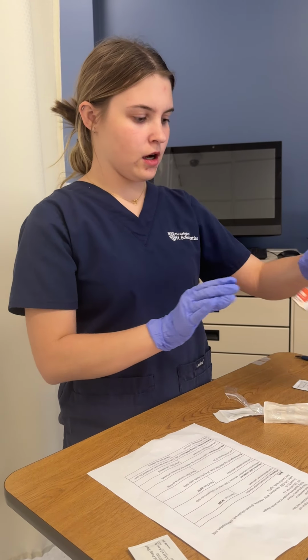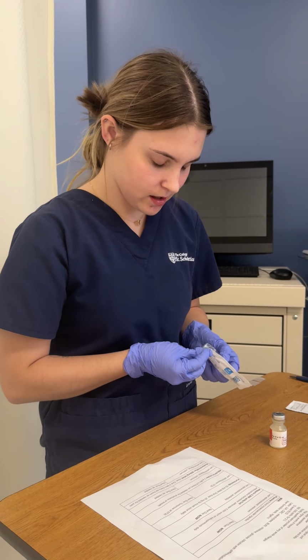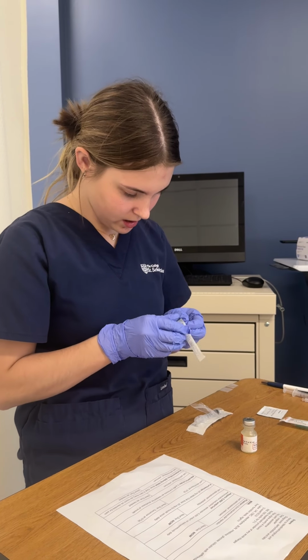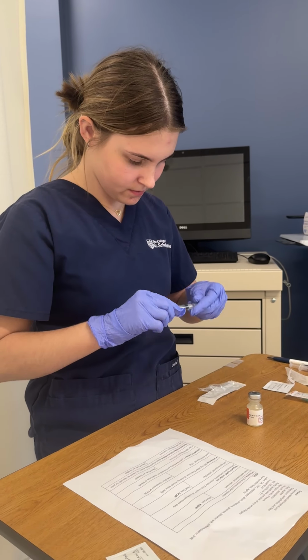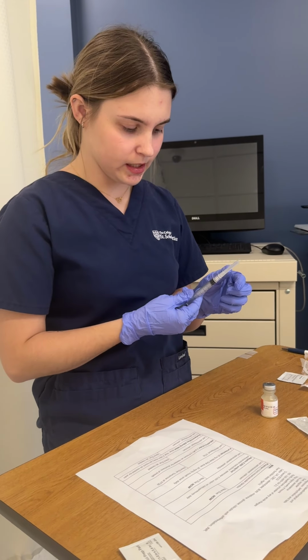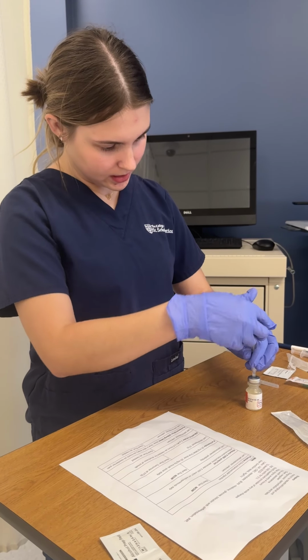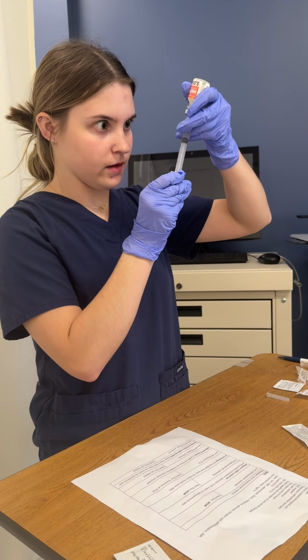And then now we're gonna draw up our heparin. We're gonna take our syringe, our blunt tip needle to draw it up. Okay, so it is 1 milliliter, so we are gonna take this off, draw up 1 milliliter of air, put that in here, and then draw up our 1 milliliter of solution.